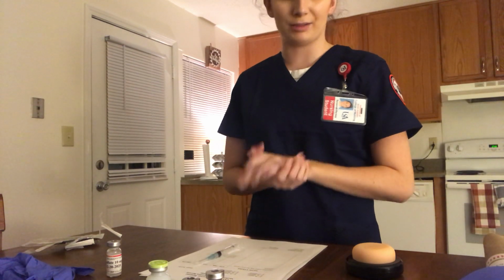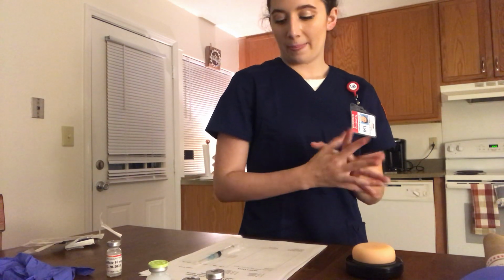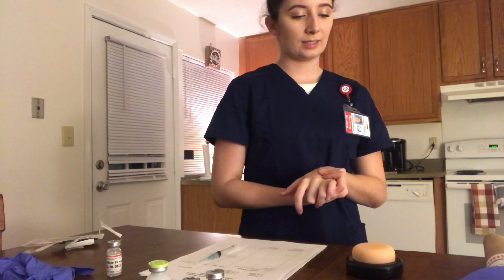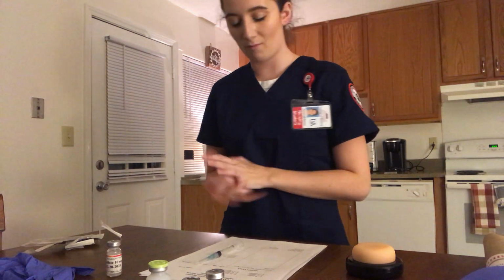After I do that, I will explain to my patient the procedure I will be doing today. Jaguar Jones, I will be giving you a 1/2 milliliter shot of morphine. It's going to be in your hip area. It's going to relieve your pain.